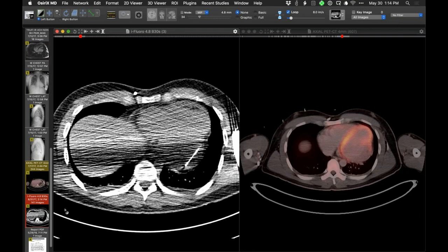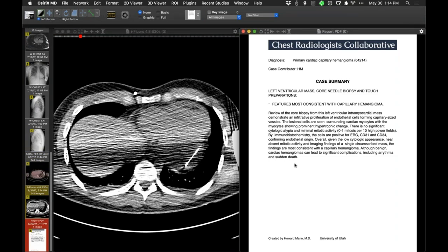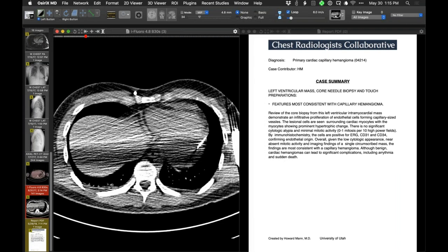Interestingly, this was biopsied percutaneously - a needle coming in, put into this part of the cardiac mass. The core needle biopsy of that yields findings consistent with a capillary hemangioma. That's interesting. I wish Seth were here to comment, because it's a rare tumor I don't have a lot of experience with. This is the first one I've seen with a pathologic diagnosis of capillary hemangioma. They talked about maybe needing cardiac transplantation - how do you take this thing out? It does talk about the possibility of blaming the arrhythmia on it. Capillary hemangioma - not the top of the list of cardiac masses.